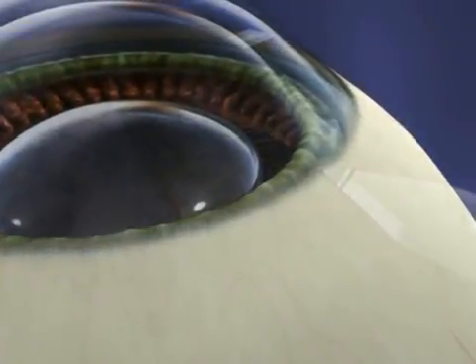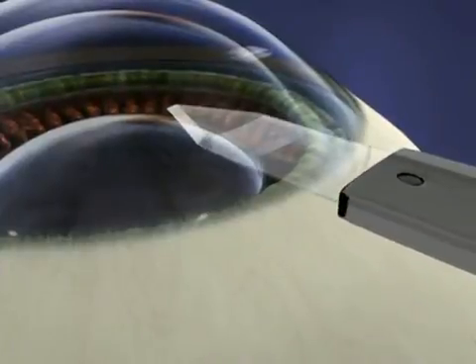Following placement of the gel, a small incision will be made through which the lens will be inserted.